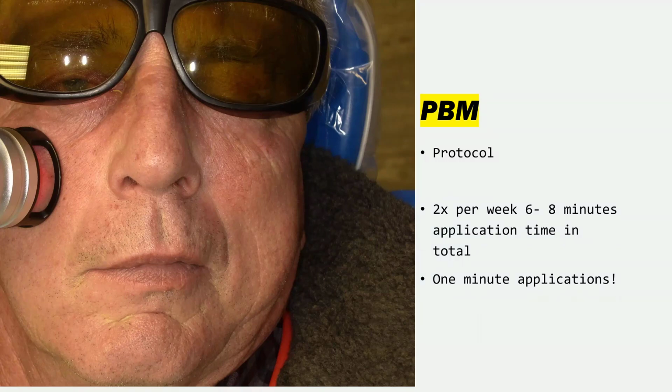Now, I'm going to show you a video. And I knew from day one I was going to help him, because when I treated him here, right where you see this attachment, I saw a little twitch down here. That was after the first treatment. So I knew I excited something and I was confident I'd get him better. You may not see it. You could try to look for it. I missed it sometimes when looking at it. I see it a lot of times. Let me show you the video.